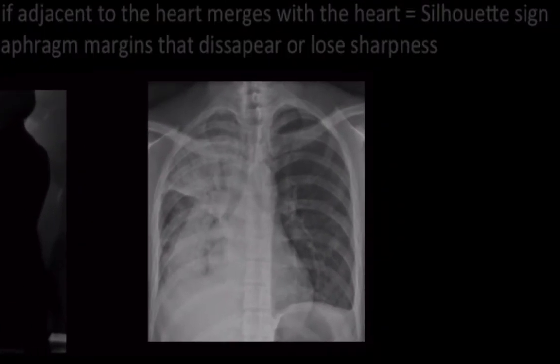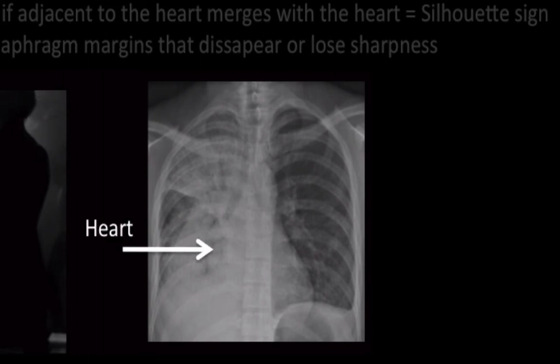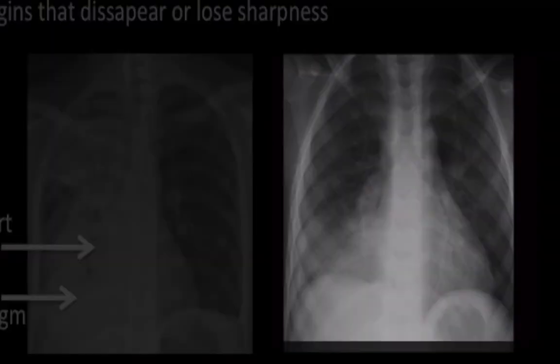Here is an x-ray example. This patient, compared to the normal one in the top left corner, has pneumonia involving the right upper lobe, the right middle lobe, and the lower lobe. You can see how the right cardiac margin and the right diaphragmatic margin have disappeared and all the white structures have become one shadow. Both the disappearance of the margin and the conglomerate shadow are referred to as the silhouette sign. This case is quite obvious, but the next example shows absence of the right cardiac margin in a patient where pneumonia might be harder to suspect.